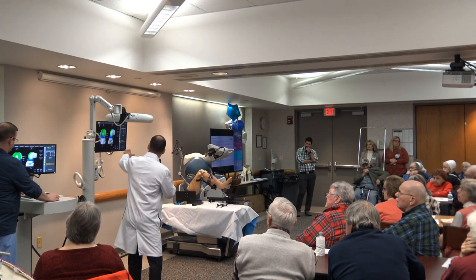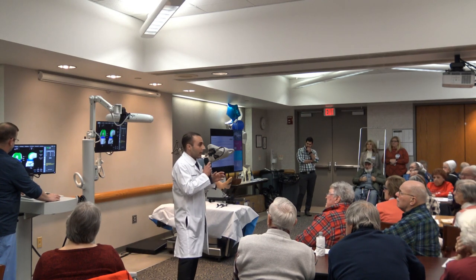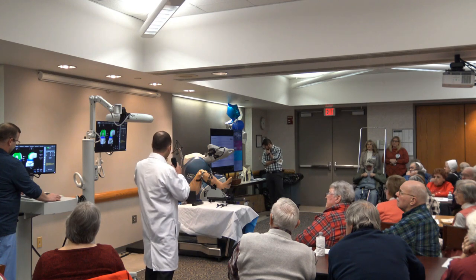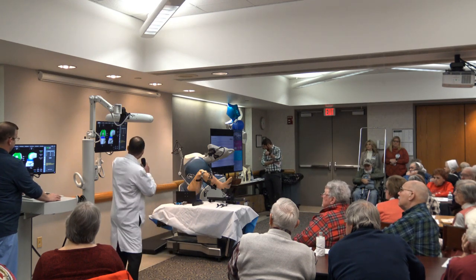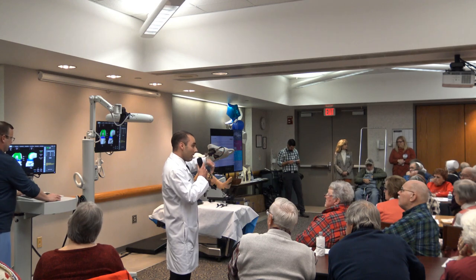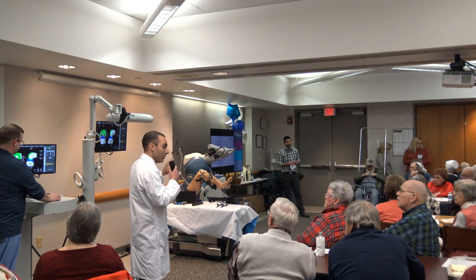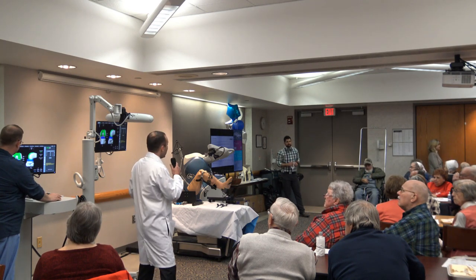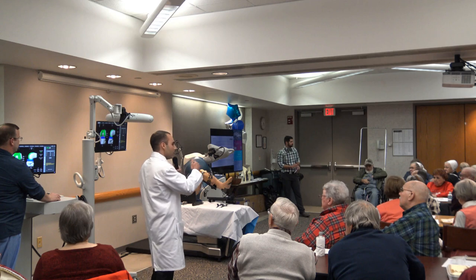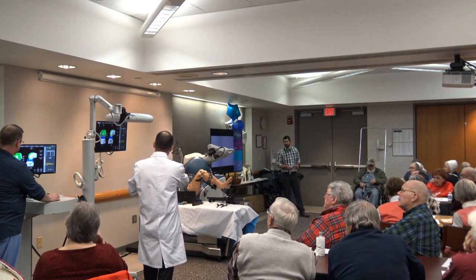If the knee is loose on one side, we can rotate the implant or shift it so the knee is balanced — both in extension and in flexion. Using the Stryker implant, which has a single radius design, if it's balanced with the knee straight and bent, it's going to be balanced all the way through range of motion. Before we make our first cut, we gather that data, position the implants so the knee is balanced, then bring the robotic arm into the operating field to make our cuts so that implants fit exactly within half a millimeter of what we planned.